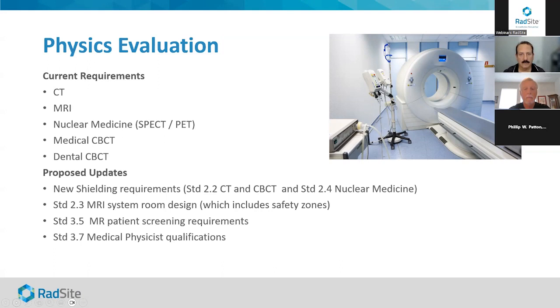So in MR, it's very similar with the parameters that obviously are appropriate for MR. So what do we do? For CT, we require phantom images to be submitted. We require an adult head, adult body, a peds head, and a peds body if you do pediatric studies. And these images have to be obtained on a phantom that we've approved. Now, we don't limit to one phantom. We actually have a couple that we approve. And from there, we evaluate and see if it meets the requirements.